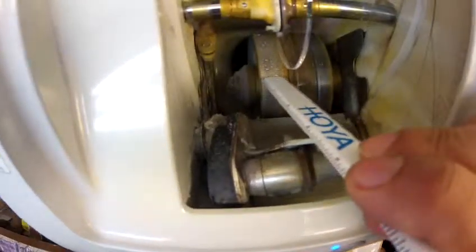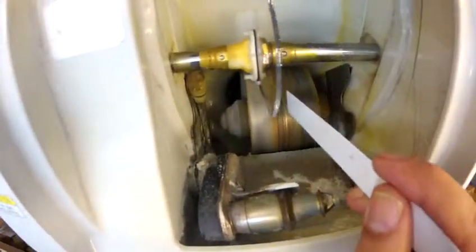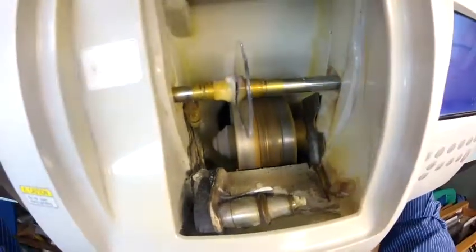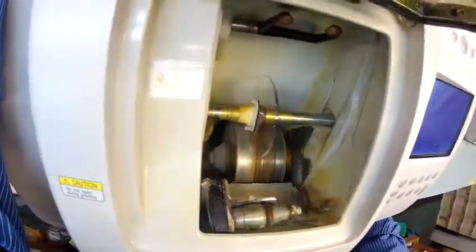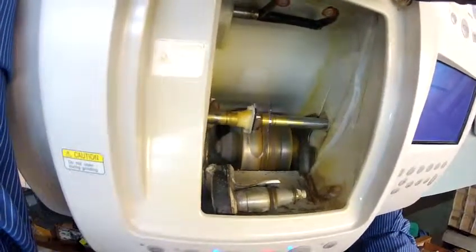The actual cutting wheel is down here on the bottom left. That's what's going to grind away your lens material. And this wheel into the center with that channel, that little valley, that's what's going to cut the bevel onto the lens. I will have to close the door in a moment, but for now I just want you to see as it touches down on the cutting wheel.